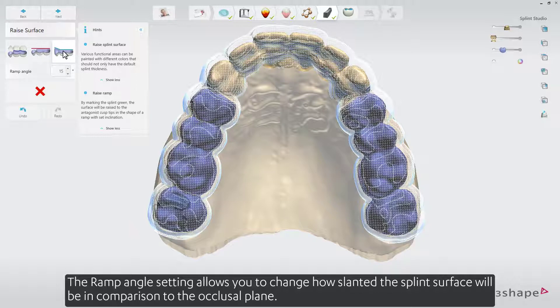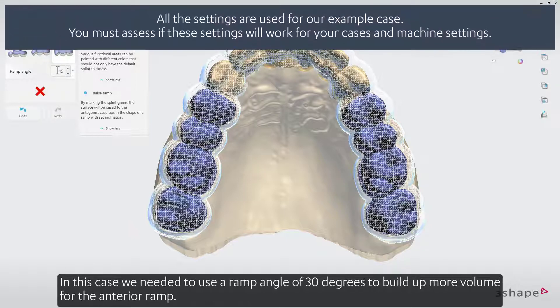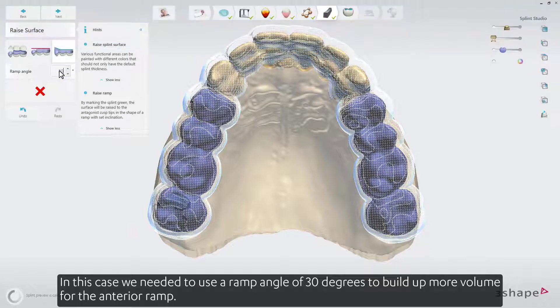The ramp angle determines the slant in comparison to the occlusal plane. In this case we needed to use a ramp angle of 30 degrees to build up more volume for the anterior ramp.